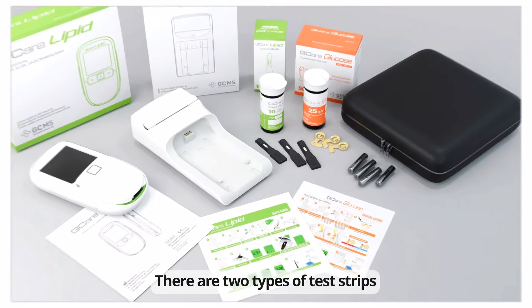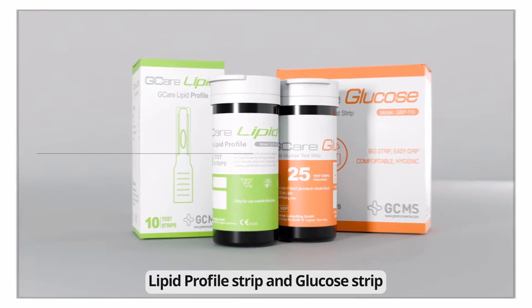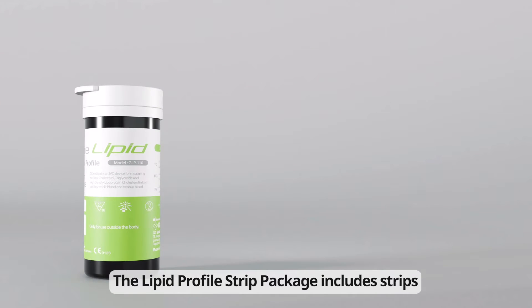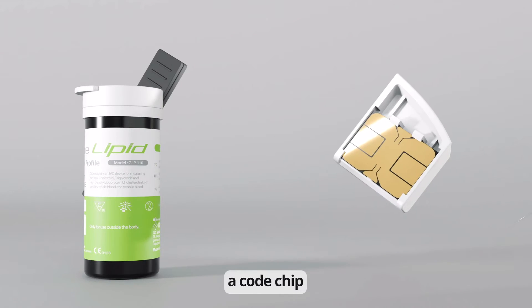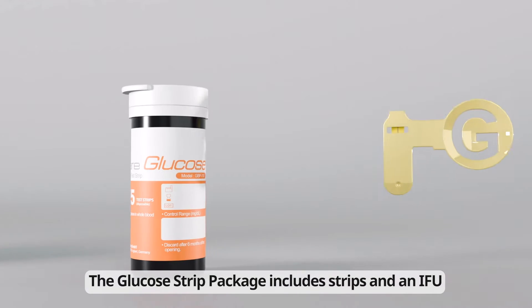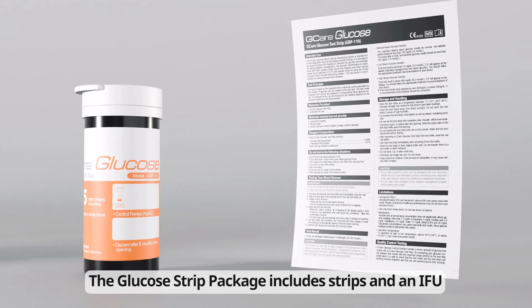There are two types of test strips: the lipid profile strip and the glucose strip. The lipid profile strip package includes strips, a code chip, capillary tubes, and instructions for use. The glucose strip package includes strips and instructions for use.